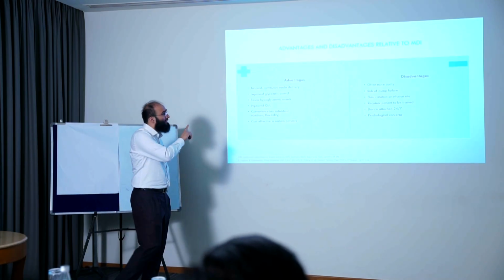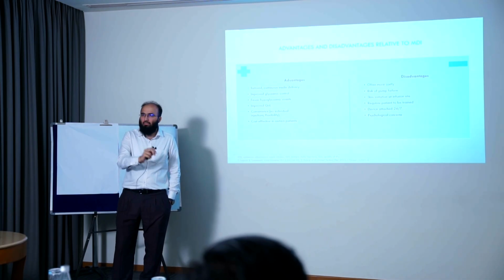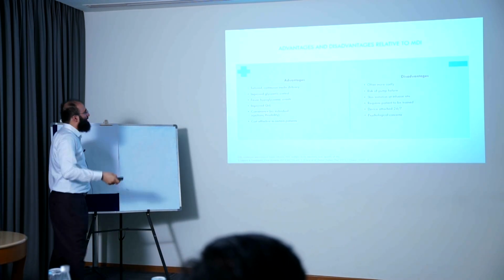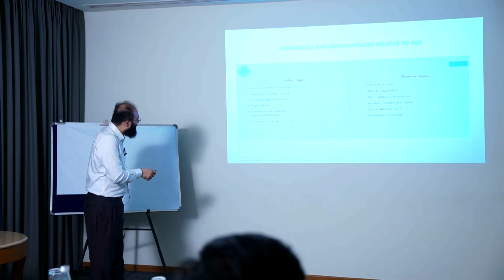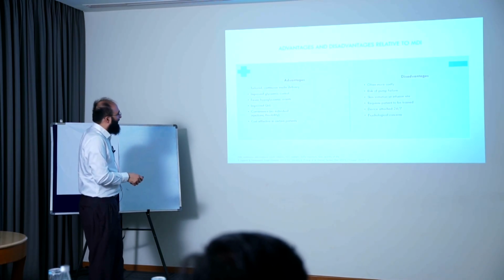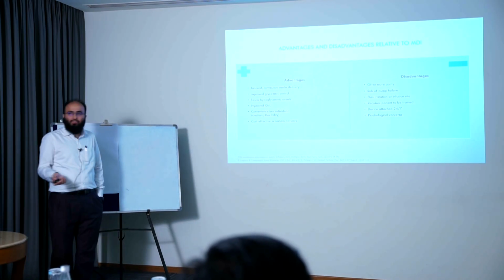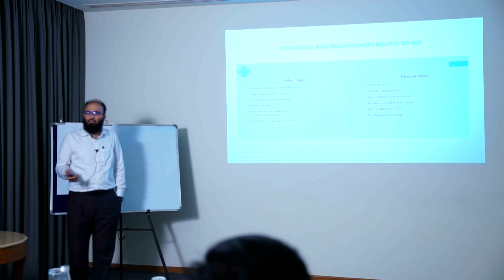Advantages and disadvantages relative to MDI. Now, it has its own advantages, it has its own challenges, but let us try to compare this CSII to a multiple daily injection regimen of insulin. So, advantages: tailored continuous insulin delivery, improved glycemic control, fewer hypoglycemic events, improved quality of life. There are no individual injections. It has flexibility and convenience. It is cost effective in certain patients. Disadvantages: often more costly.